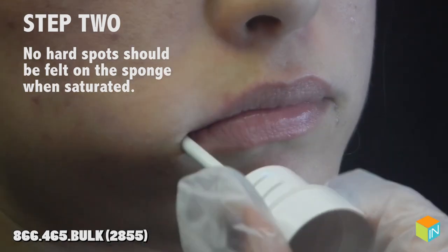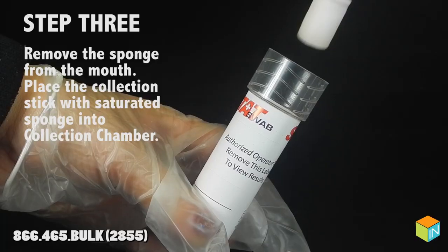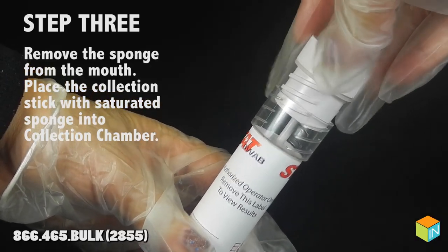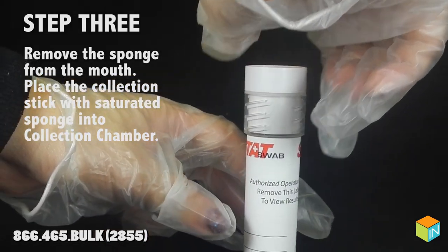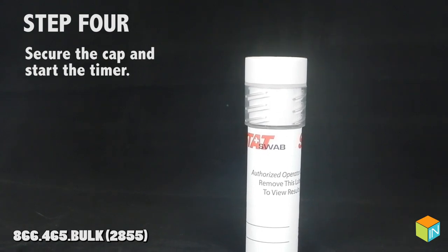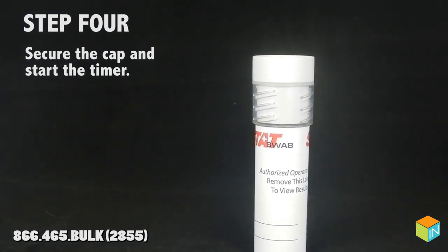No hard spots should be felt on the sponge when saturated. Step 3: remove the sponge from the mouth. Place the collection stick with saturated sponge into the collection chamber. Step 4: secure the cap and start the timer.